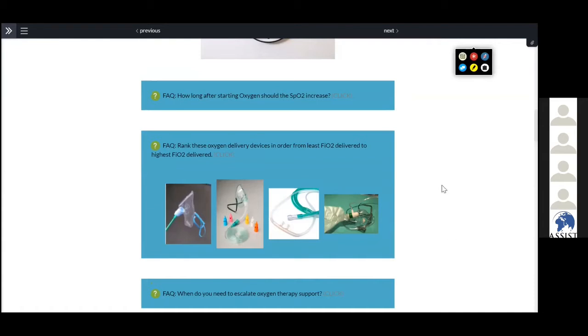Patient in respiratory distress, patient with fever, patient in shock, and other examples. Patients who are being admitted to the hospital. Those are the things they discussed in the video. Especially that in inpatients, we check pulse oximetry all the time.